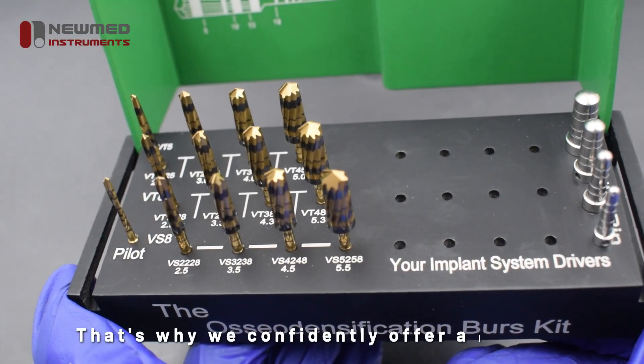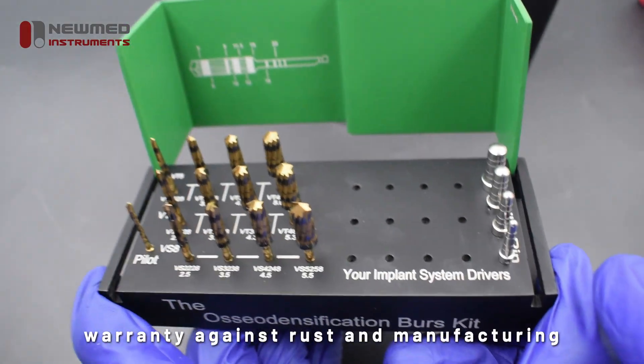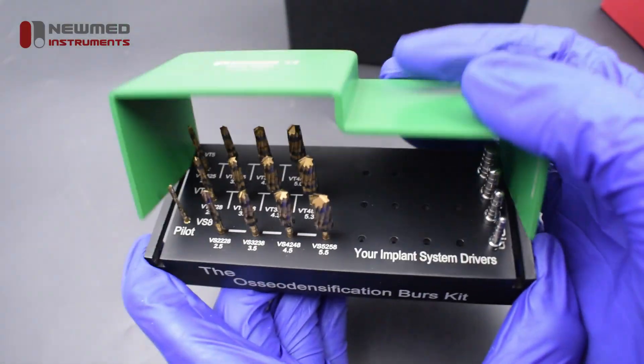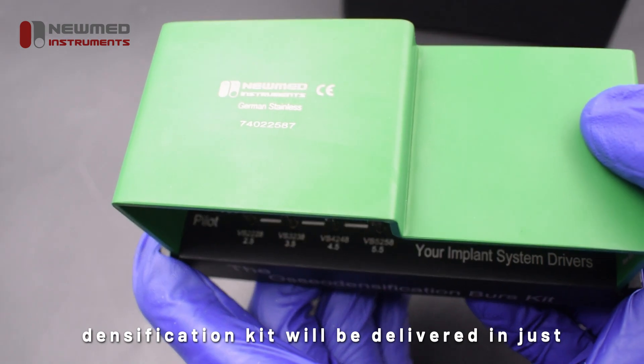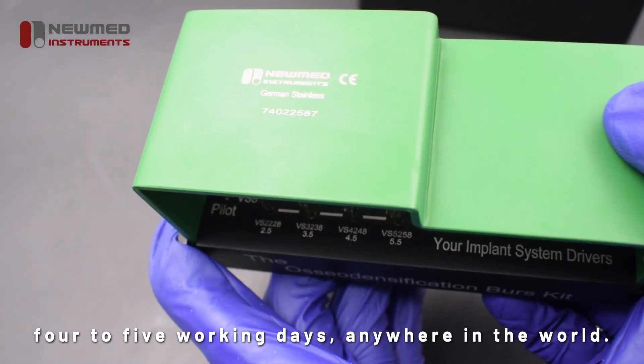That's why we confidently offer a lifetime warranty against rust and manufacturing defects. In stock and ready to ship, your osseodensification kit will be delivered in just four to five working days, anywhere in the world.